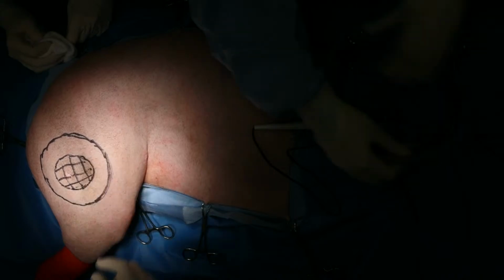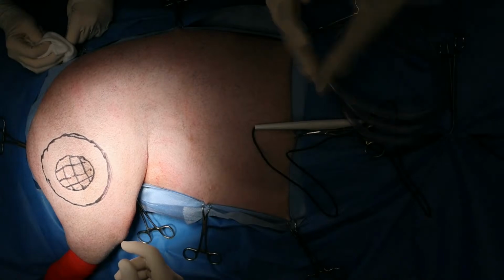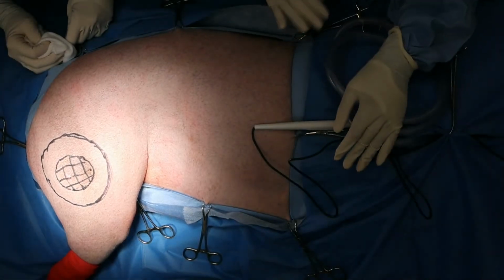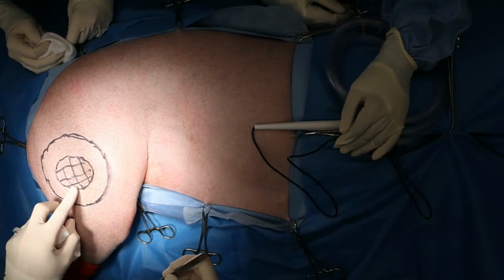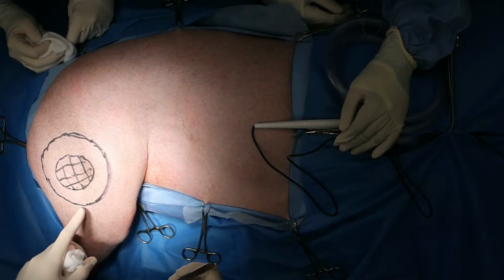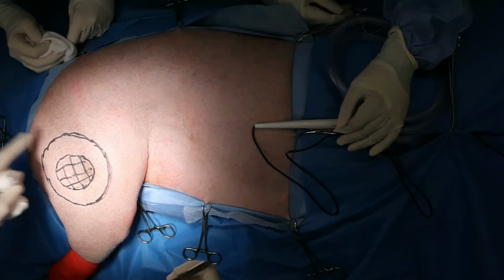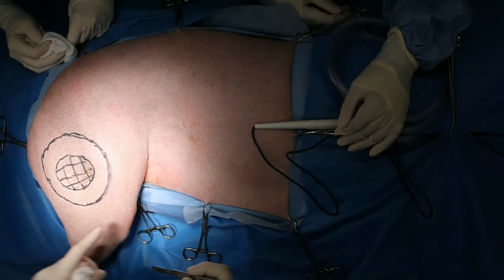There's a mass that's developed on the right lateral thigh, sitting right here, and then they did an aspirate on it. The primary care vet came back as a mast cell tumor, and the thought was that it was a sub-Q mast cell tumor. We'll just have to get that confirmed on histopath. And so we're doing a wide local excision. We did do staging just in the form of an abdominal ultrasound.